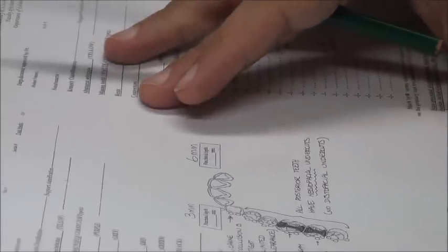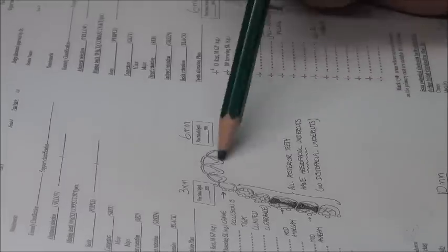Okay, the upper left, please. Kennedy classification. Class 2. Any modifications? None. Tooth tissue support. What's the type of support here? Tooth tissue support. Okay. That's it. The design is finished. Put an open lattice, put an RPI system, and that's it.